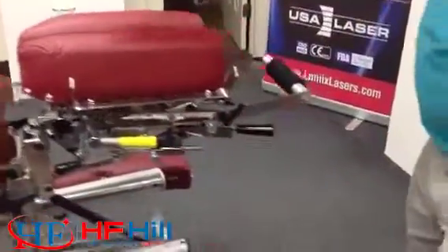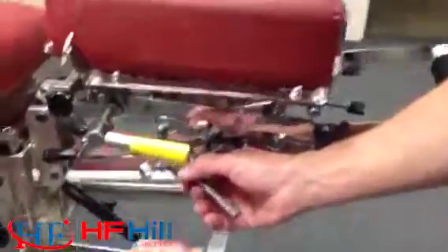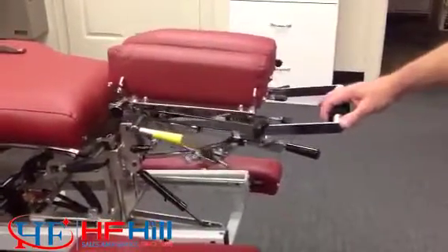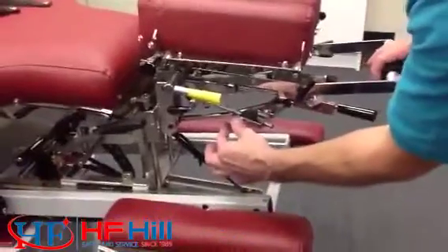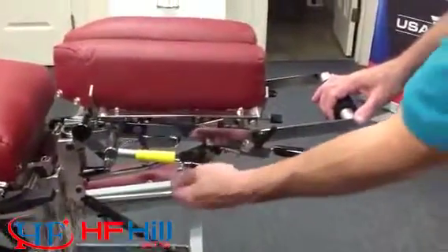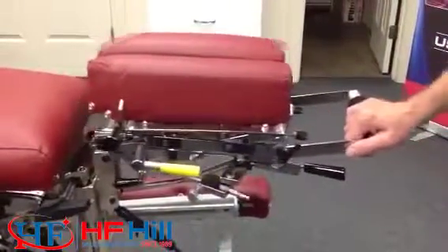Okay? So the headpiece also does long axis traction. As we pull this knob out, it's a spring-loaded knob, so you pull it out and turn it. When you pull this knob out and turn it, you have your full range of traction. Again, that's about 5 inches, and this rod here has a hole in it. When you turn this knob, again, it's spring-loaded. Now the knob just went back in place, but when the hole goes over top of the rod or the knob here, it locks back in. So we locked in our traction, and again, you just pull it and twist it, and so you unlock it.